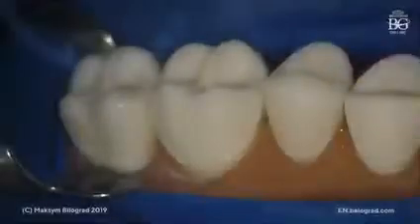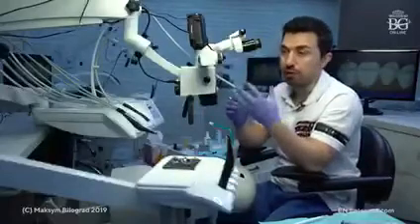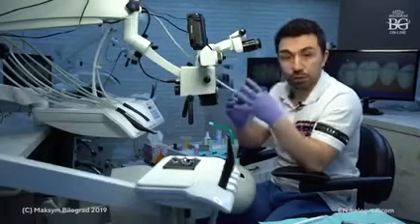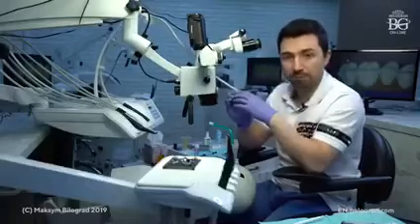which is really, really important, because in thin ceramic restorations, literally in veneers that are completely reliant on bonding, the surface fit plays a more important role than the fit to the finish line.